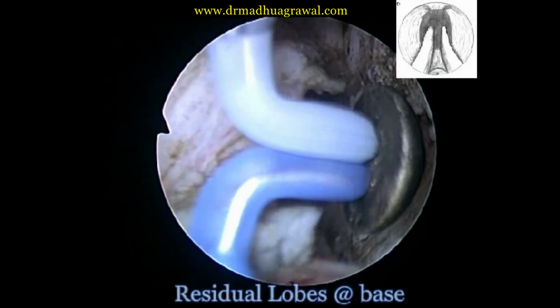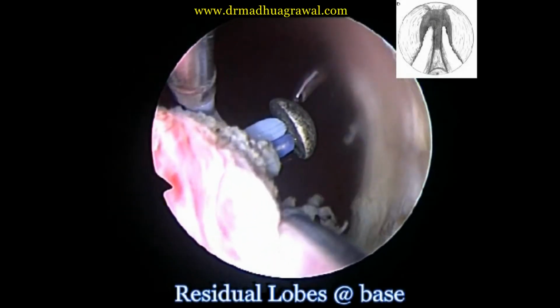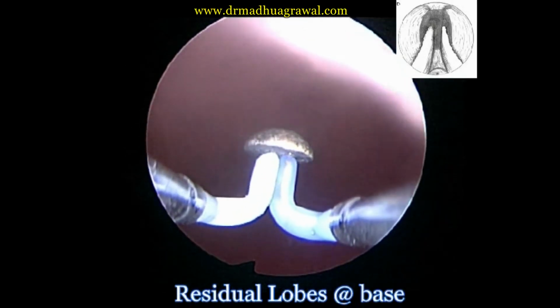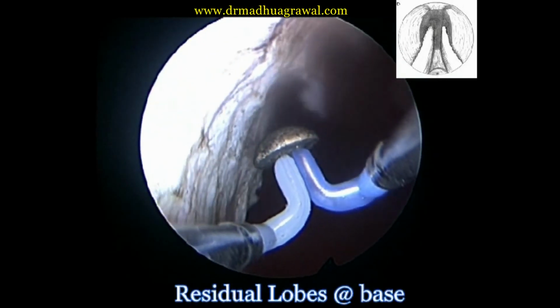Here, we can see both lobes enucleated and fallen medially, attached at the base, at 6 o'clock position. The capsular fibers can be seen all around with fair hemostasis.